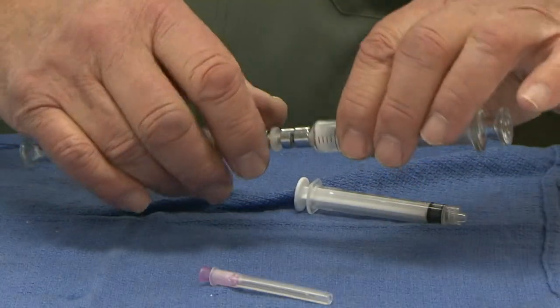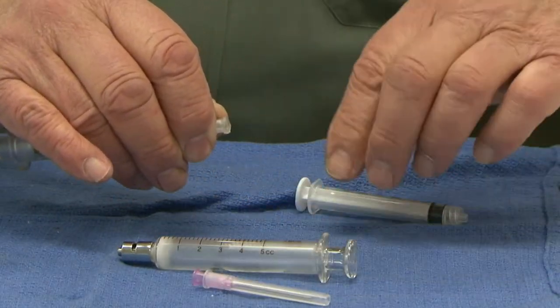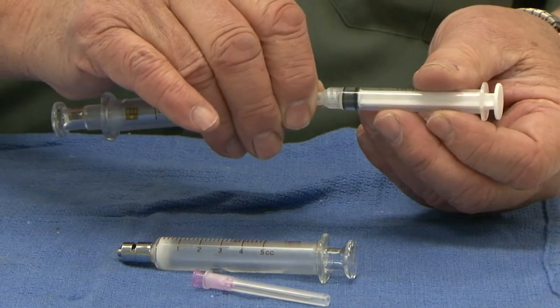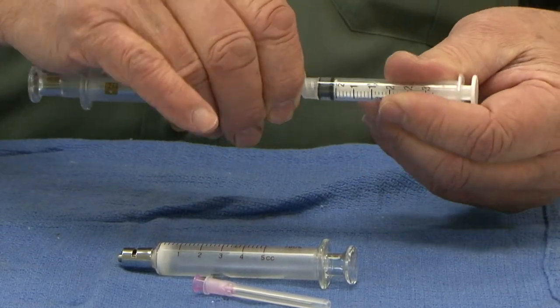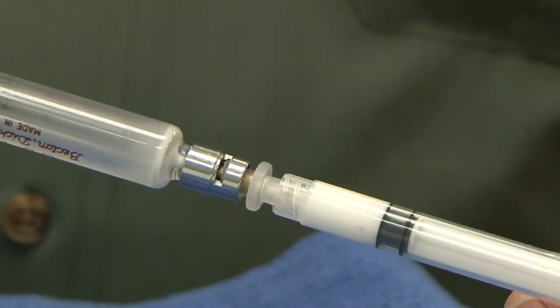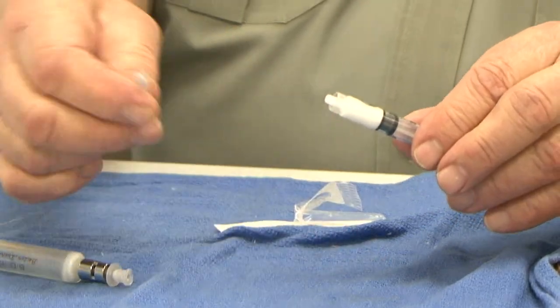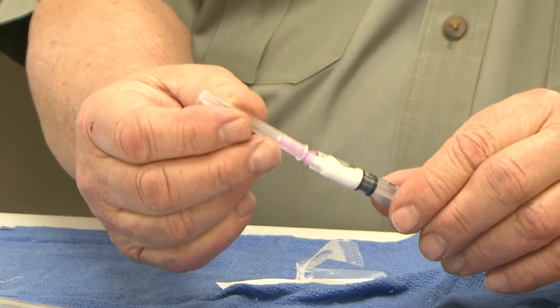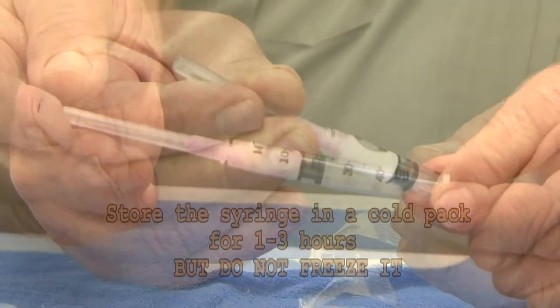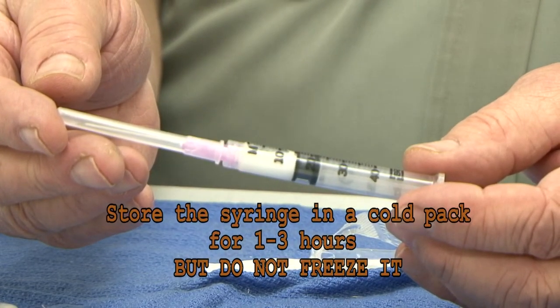If you are loading a hand syringe, attach the glass syringe with the emulsion in it to a plastic disposable syringe by means of the plastic lure lock connector and push the vaccine emulsion into the plastic syringe. Disconnect the glass syringe and place a sterile 1.5 inch 18 gauge needle on the plastic syringe. Store this plastic syringe in a cold pack for up to one to three hours, but do not freeze it.